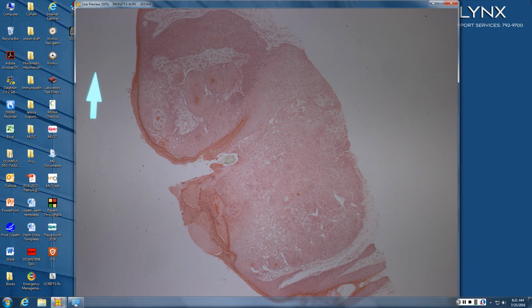Okay. So, Brian, what's this? Relatively similar look from the last one. Relatively similar, except is this an exophytic lesion or is this an endophytic lesion? Yeah, this is more endophytic. So an endophytic lesion with all of these little whorls. I think about inverted follicular keratosis.